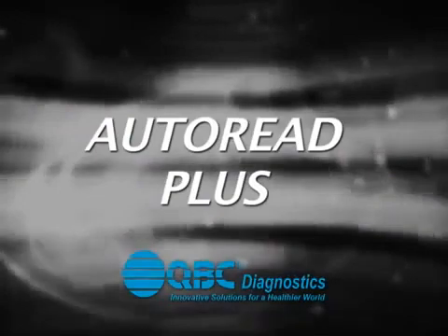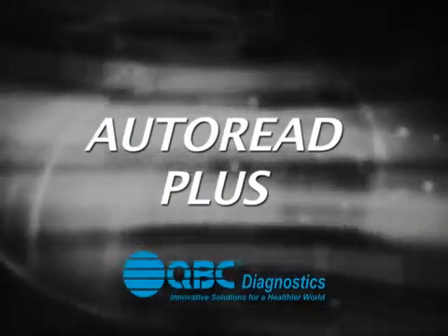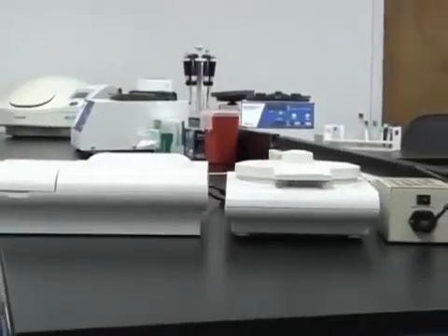The QBC Autoread Plus System. Thank you for purchasing the QBC Autoread Plus System.